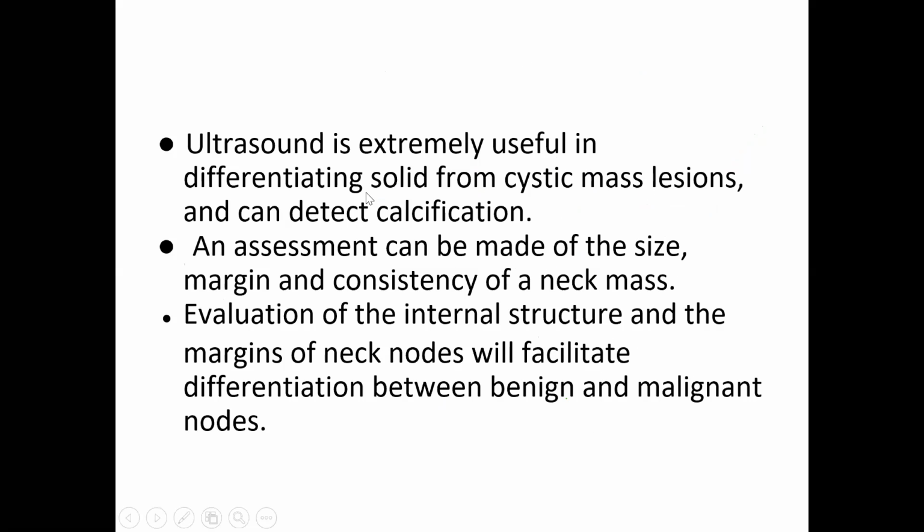Ultrasound is extremely useful in differentiating solid from cystic mass lesions, and it can detect calcification. An assessment can be made of the size, margin, and consistency of a neck mass. Evaluation of the internal structure and the margins of the neck nodes will facilitate differentiation between benign and malignant nodes. So keep in mind, extremely useful.